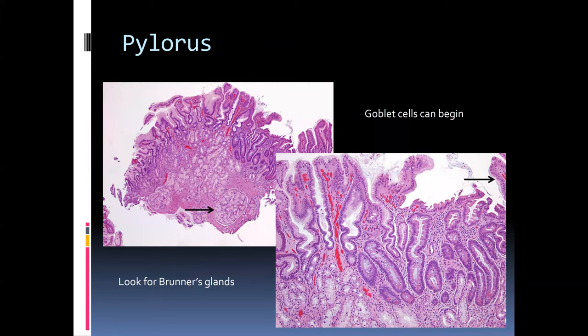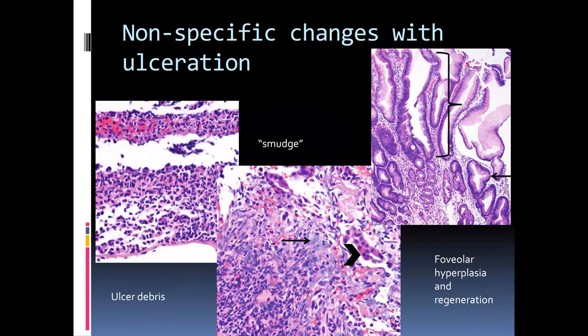As we move a little further, we should expect to begin to see some Brunner's-type glands migrating from within the mucosa down into the submucosal space, and we can expect to begin to see some goblet cells, as highlighted here on this higher-magnification view.